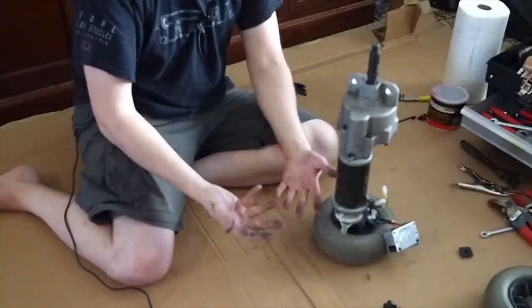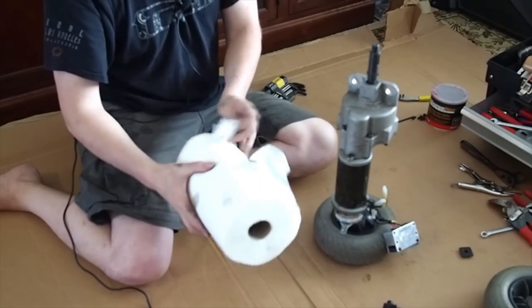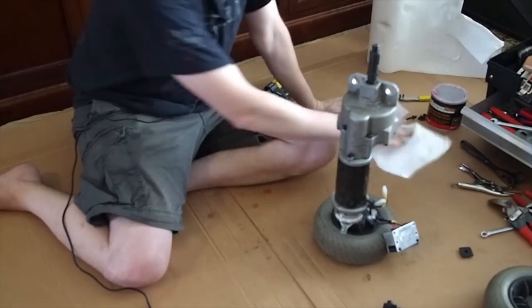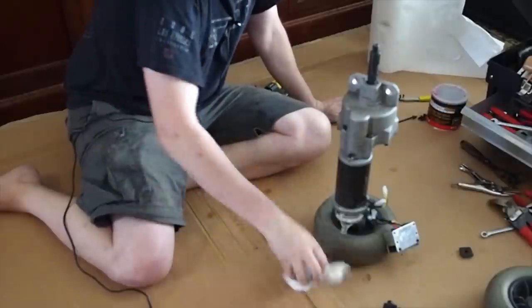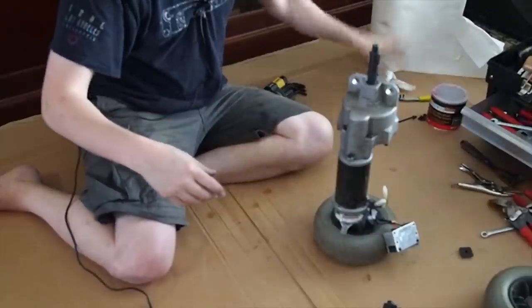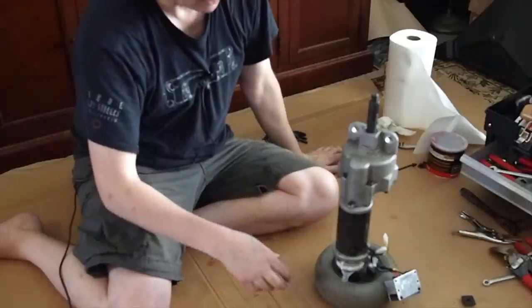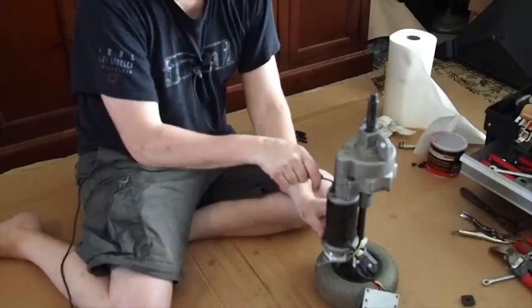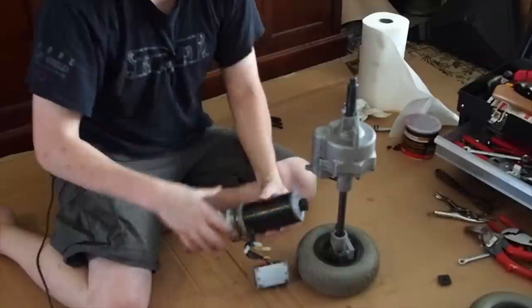I also notice my hands are pretty dirty, and this is just from the outside dirt. Once we get inside here, it's going to be even worse. This is very greasy on the inside of this, and any dirt at all is going to be on everything. And I try not to get dirt on the inside of this thing. I'll probably have to wipe it down with paper towels, mostly to clean up as we go. So let's start in on this. And I think this is the right Allen wrench. Yep. And I'll just start pulling this apart.